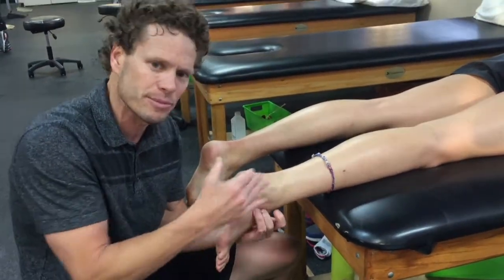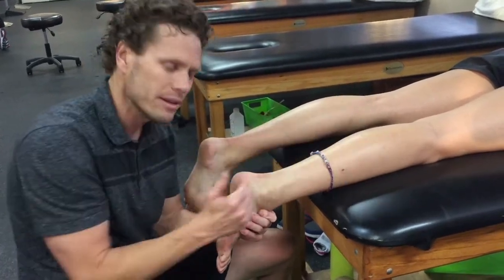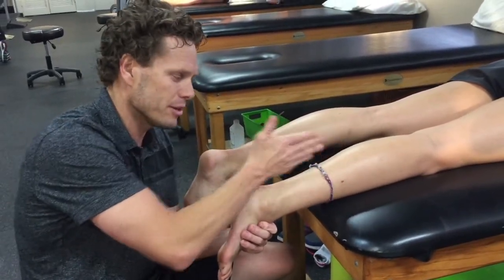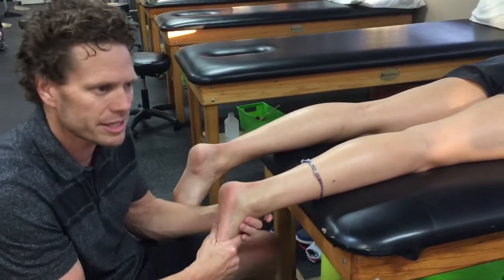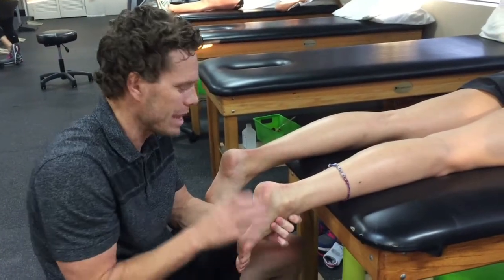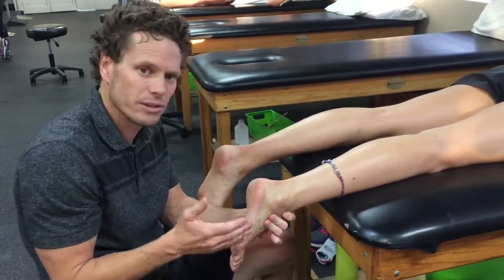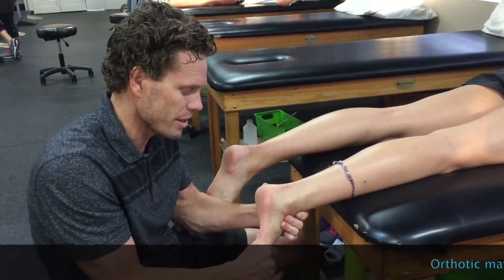That tells me right away we're going to have some issues when we stand up with control up the chain — whether that translates into the tibia moving too fast, or knee pain, or hip pain. Sam actually has an ACL tear, so the question is: does her foot have influence on her knee? Absolutely it does. Was that the result of a tear? Not sure, but it might be an influence, so we're going to assess that.